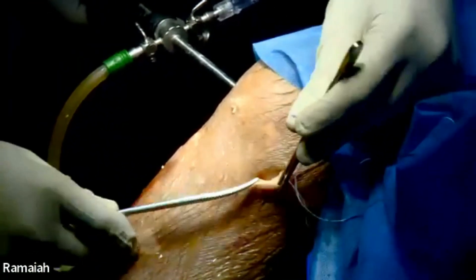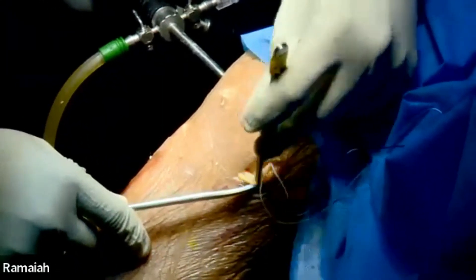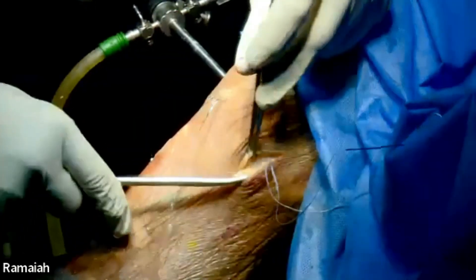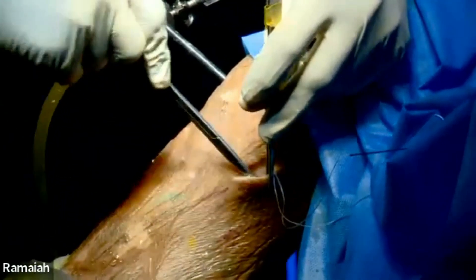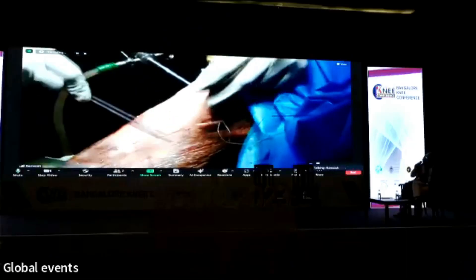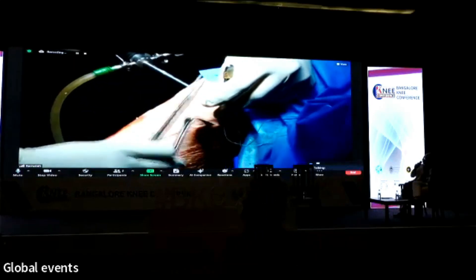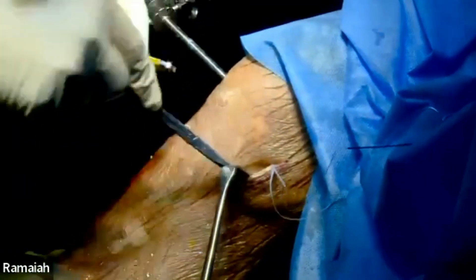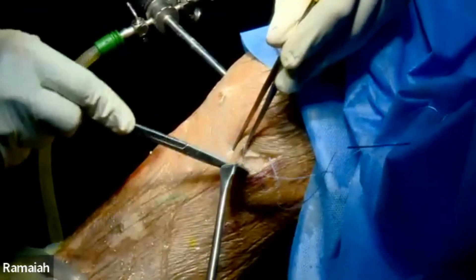This is the sartorius fascia. Once you are into the sartorius fascia, do blunt dissection like this, then you can see the posterior medial part of the capsule. Semi-membranosus is on this side and the medial head of gastrocnemius is here. What I am showing is the capsule only — the posterior medial capsule.